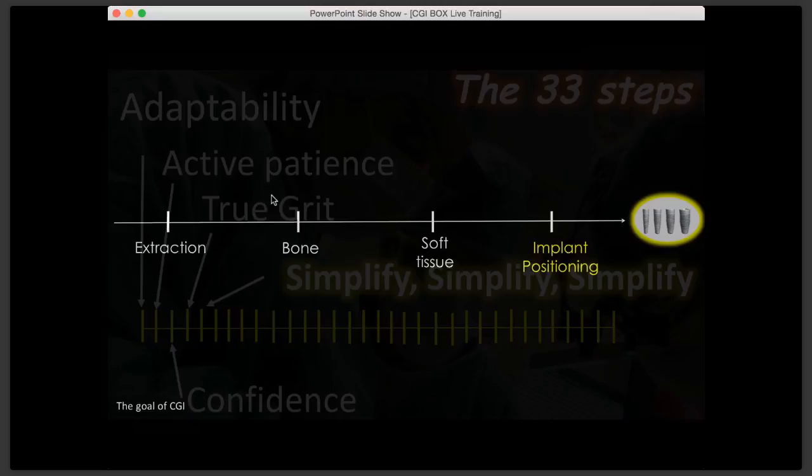I just spoke to a dentist last week, and he said, I'm spending $100,000 a year on impression material. I mean, that's a lot of money. Buy an optical scanner. Why not? Okay. Now, once you have an optical scanner, it makes your life easy. The file is an STL file, for stereolithography.